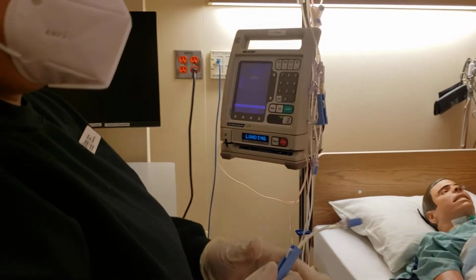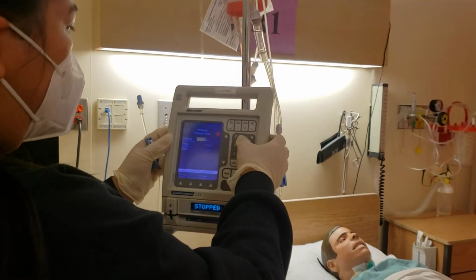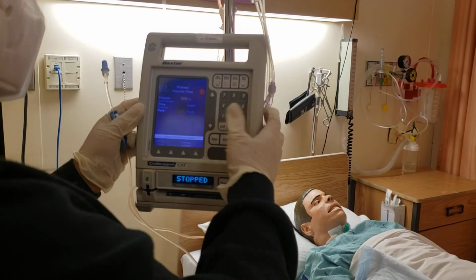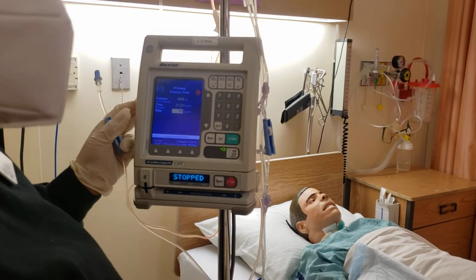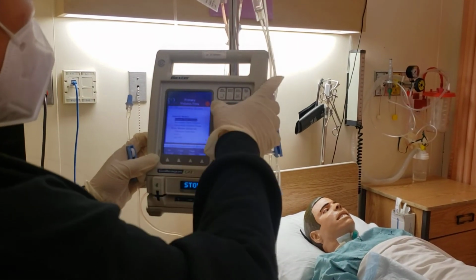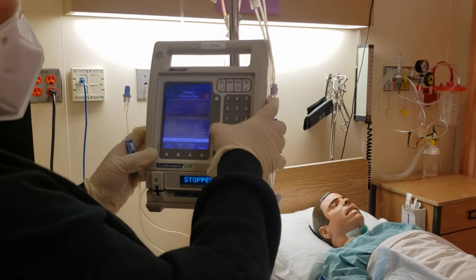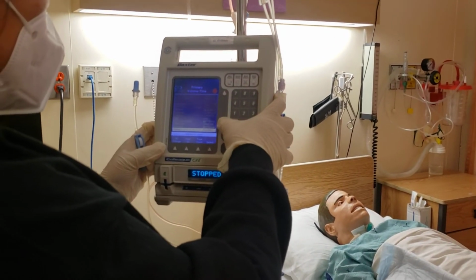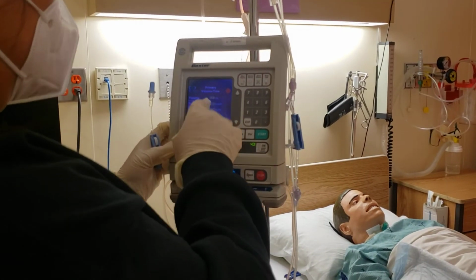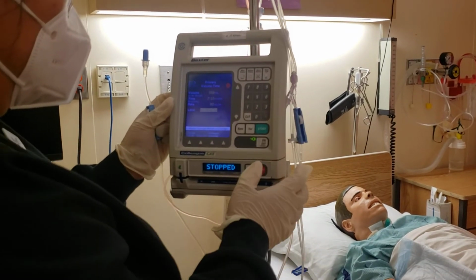The volume of our bag is 358, and then the rate, we'll set it at 50 cc per hour for the first 15 minutes. Then we're going to change the mode, label the line to red blood cells. So select red blood cells, 358, and then we're going to confirm.